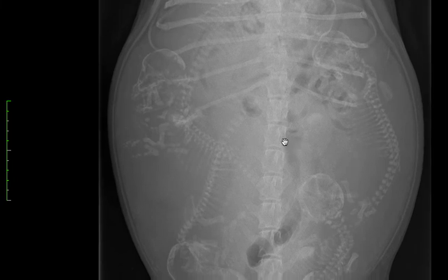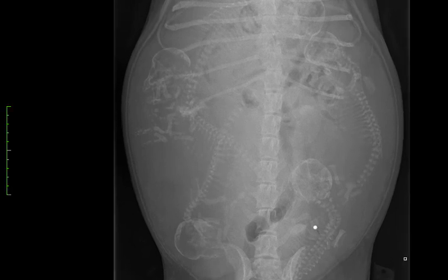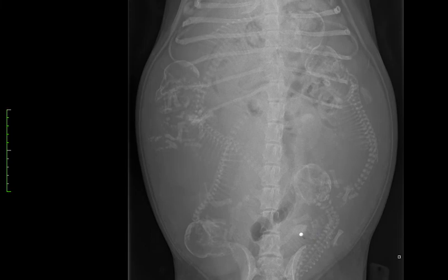So a sign of puppy distress that I don't see here would be malpositioning of the puppies, which can be, if they lose vitality, then they can lose that passive muscle tone and that moving around that they would do if they're healthy. So radiographically, if you look, most of these puppies have a uniform soft tissue opacity, so I'm not seeing any gas superimposed or any concerns radiographically for fetal distress.